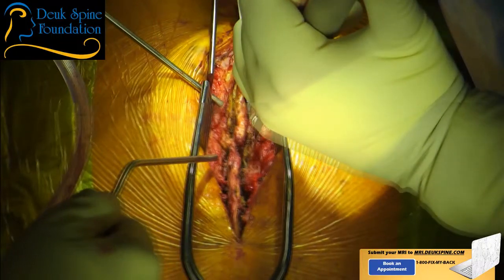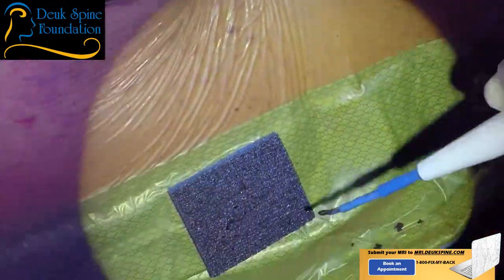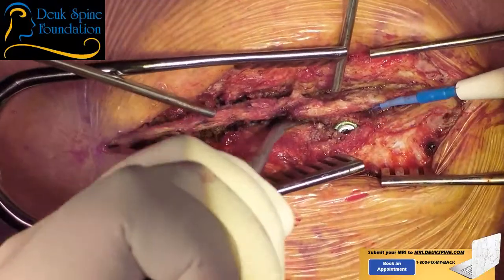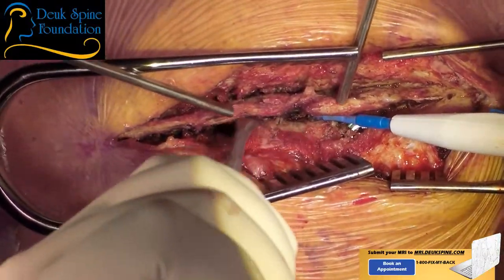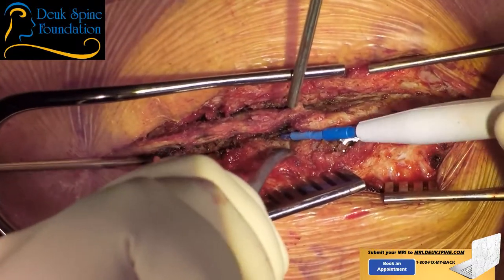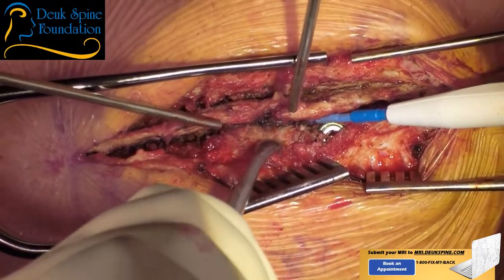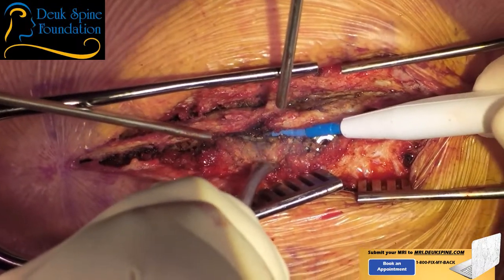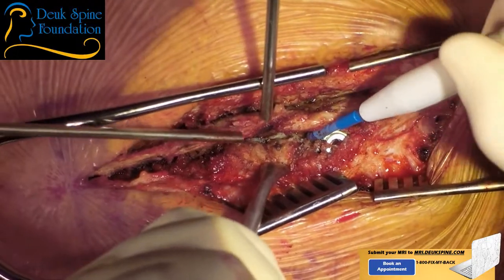The tissues after you've done spine surgery back here are always going to be scarred. And you can see the muscles are well preserved, but there's still scar tissue. Suck here. And we don't have to get out as far lateral as we have in the past because we were doing a fusion. Because we're not fusing today, we're just doing a decompression.